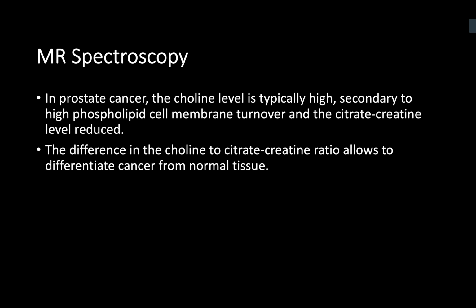Yeah. Even though we don't use MR spectroscopy nowadays, there could be questions on MR spectroscopy. Can you tell me about MR spectroscopy and its previous use in prostate cancer? So MR spectroscopy, I'm not exactly sure how that works, to be honest. Because it's not used nowadays. It was a big thing when the MRI initially came in, early 2012 at that time.